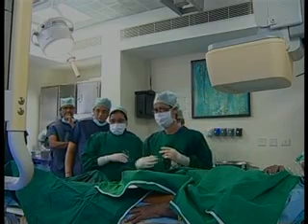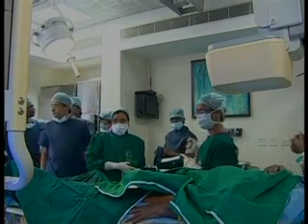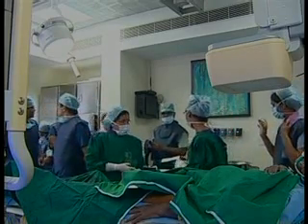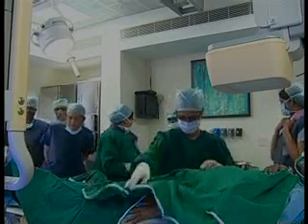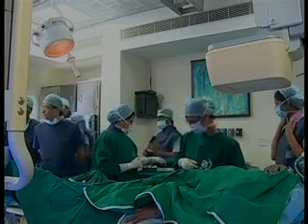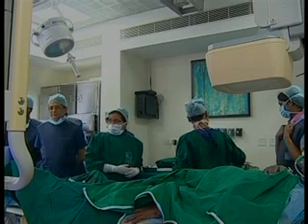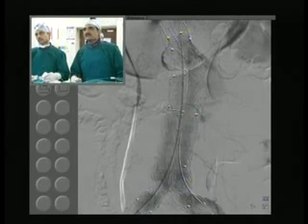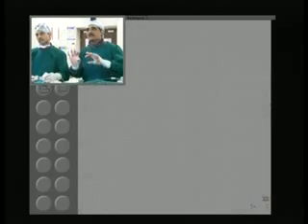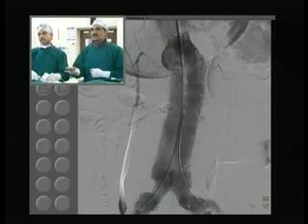Okay, deflate. We are just dilating that neck again. Can you show the previous angio? Yeah, we finished everything and we did this angiogram, and it looked good, except there's a very slow, late type 1 leak from above. It is coming from just near that left renal artery. Now this may stop on its own, but I thought I'll just balloon it once more and maybe appose that a little better. And we'll then accept whatever we got.